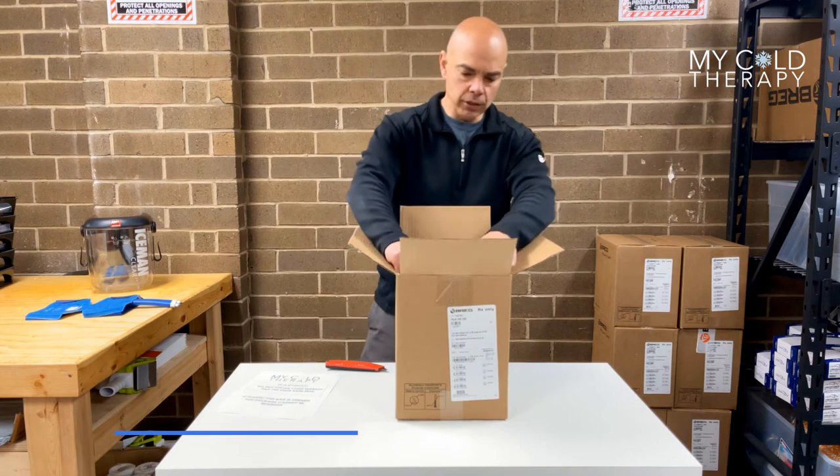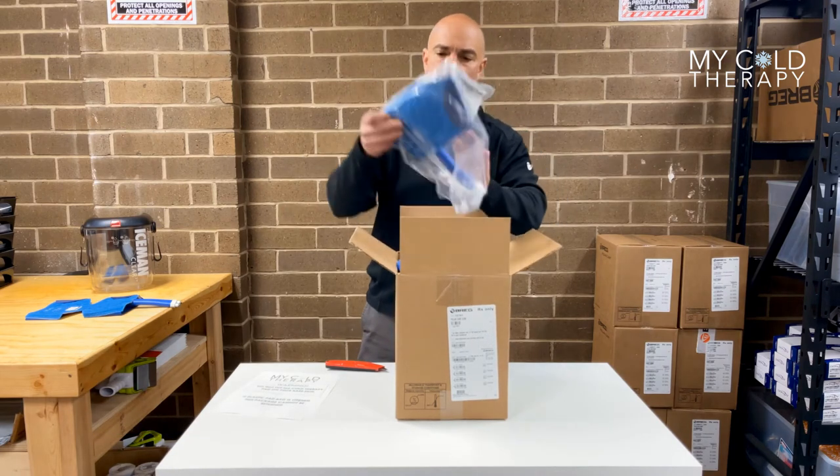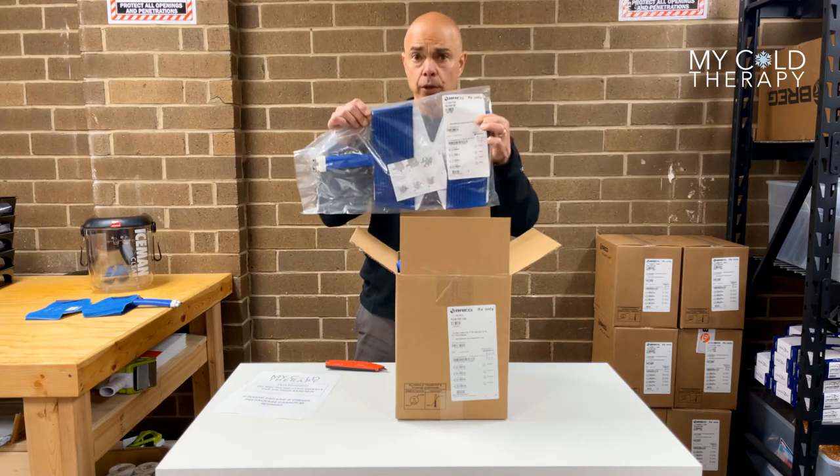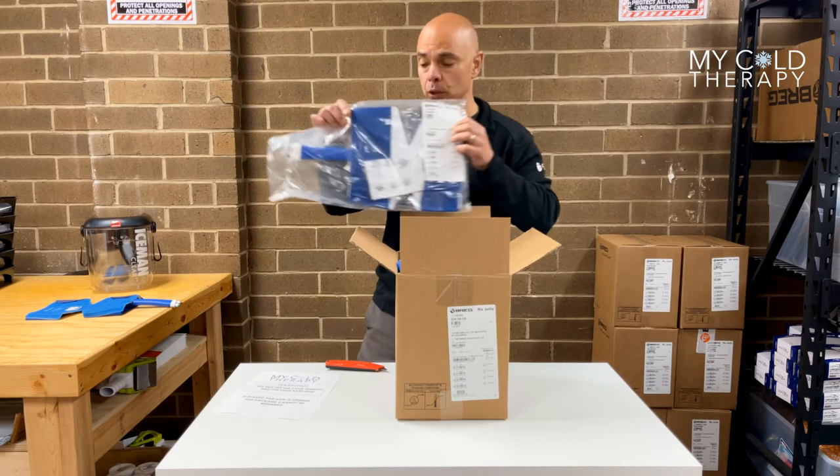In this particular case, this person had ordered a knee pad. The first thing you want to do is check the front where the part number is and make sure that's the actual knee pad and the pad that you want.